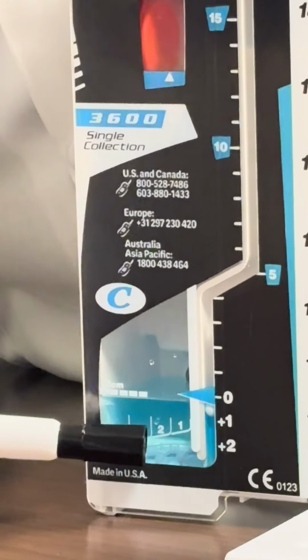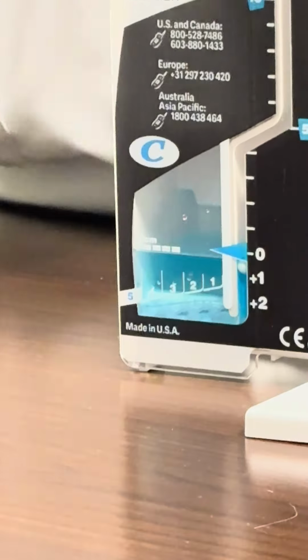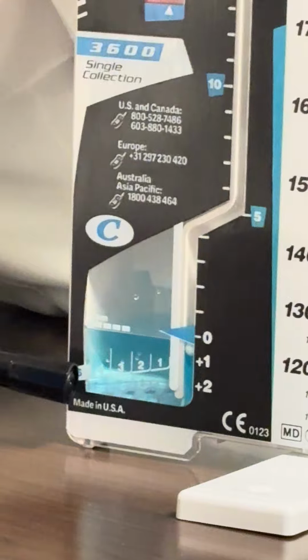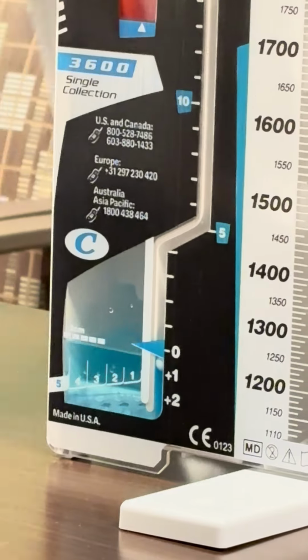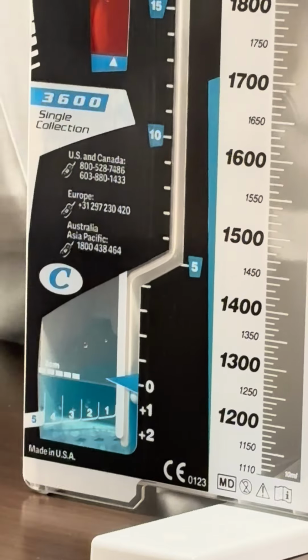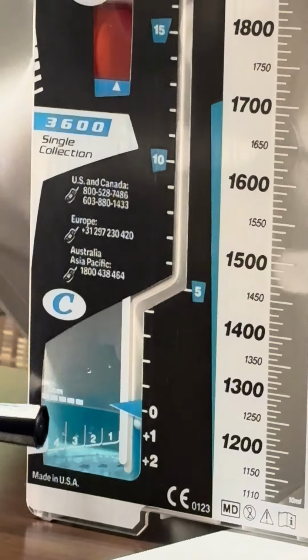You might hit 2 or 3 bubbles, the 2 or 3 level here. Somebody with a raging air leak, it'll hit bubbles in this 5th chamber here. So that really grades the air leak for you. Okay, so you can start to talk apples to apples in terms of, I have a small air leak, moderate air leak, large air leak.